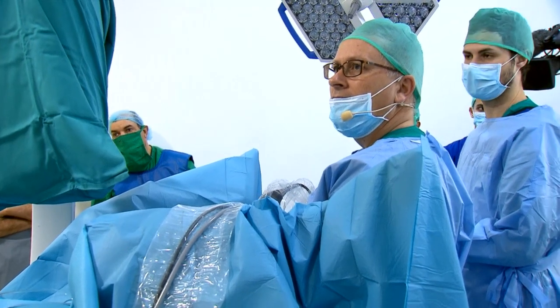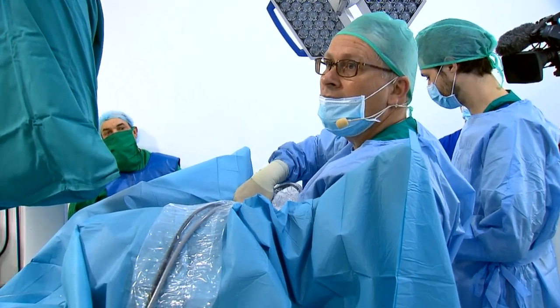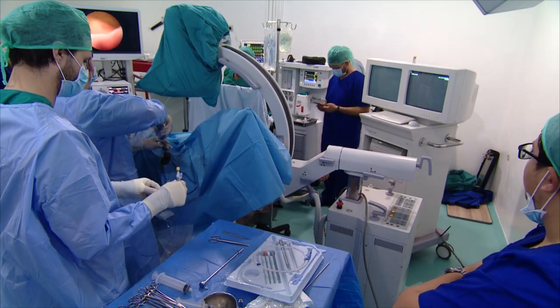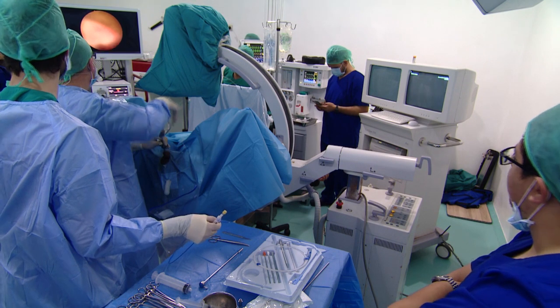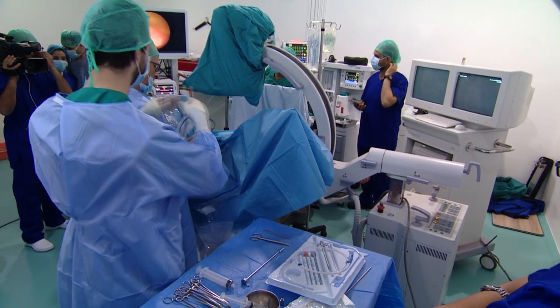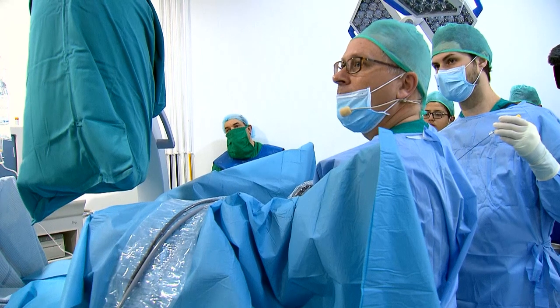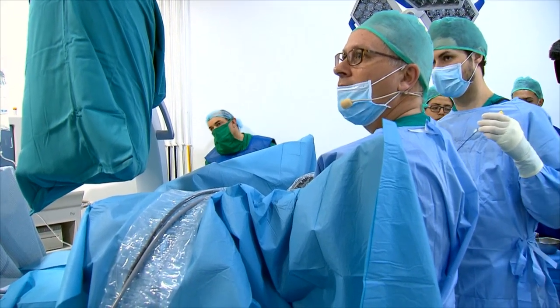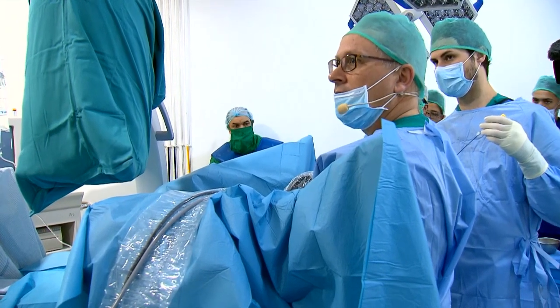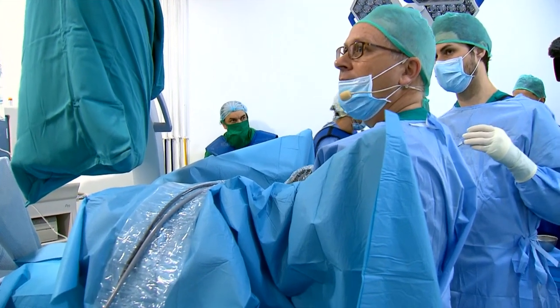But of course, when we are doing ureteroscopy, we place a small catheter to have an empty bladder. But in this first entry, to gain time, we do a small exploration, then we insert the catheter. But yes, you are talking about the standard thing, what we have in the textbooks. But I'm talking about why. We have to avoid doing an economy of maneuvers. Yes, you're right, but particularly the distal third of the ureter is very fragile, and sometimes after removal of the balloon catheter, it causes a certain obstruction due to edema. Therefore, I really recommend always to empty the bladder, and you have no problems. We can discuss it later on.